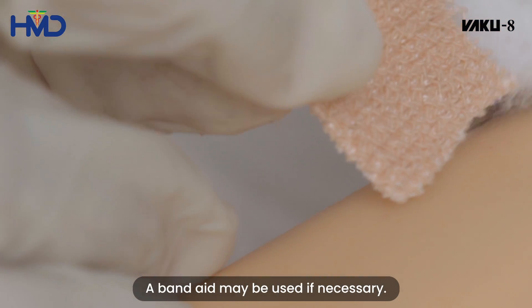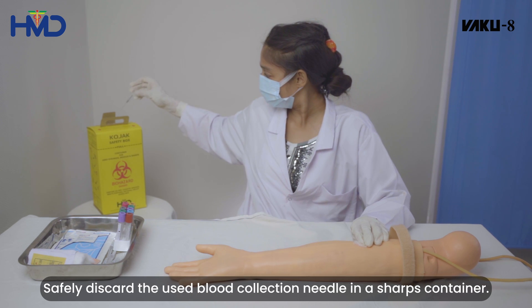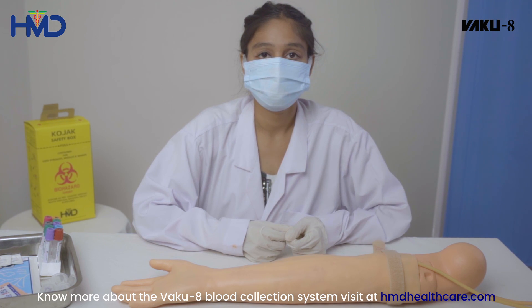A band-aid must be used if necessary. Please observe the site for hemostasis before the site is covered with a band-aid. Safely discard the used blood collection set in a sharps container. For more information about the VAKU-8 blood collection system, visit hmdhealthcare.com.